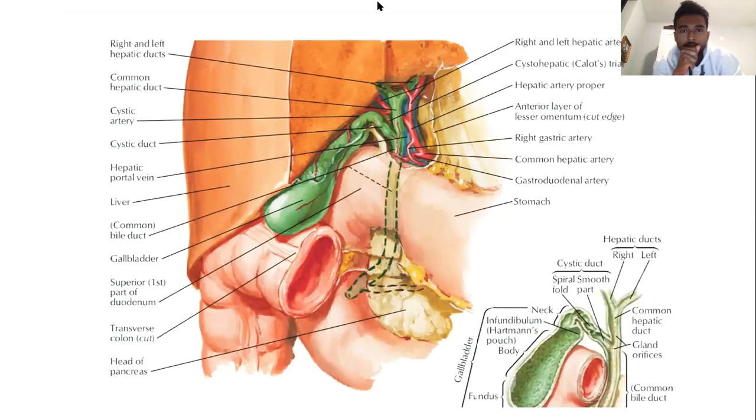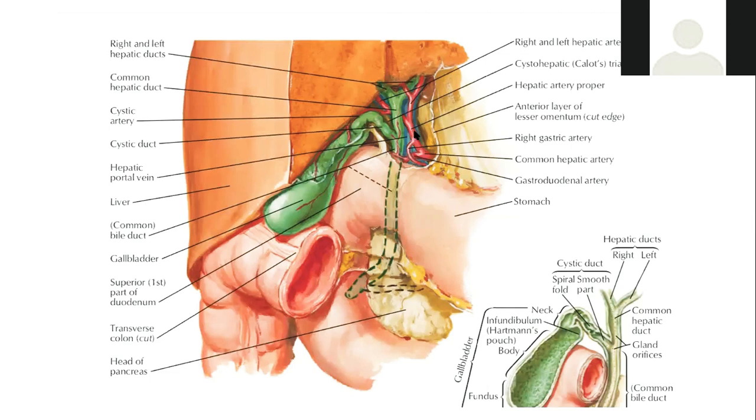And then I think this is what I was talking about. Can you see that this is the liver fissure, right? This is the gallbladder and the portal veins here. So you can see how it would make that exclamation point, right?